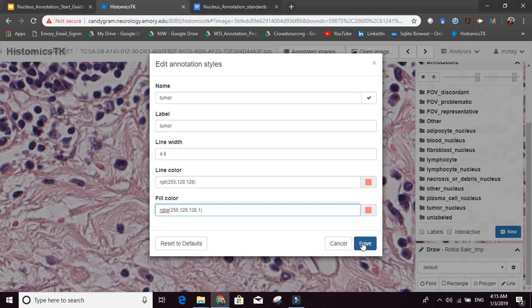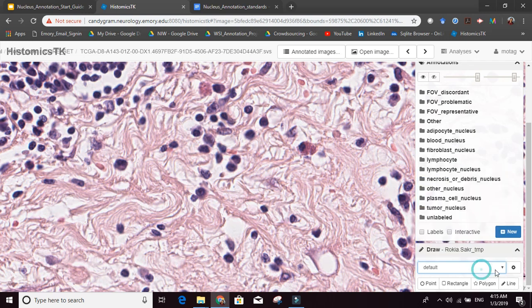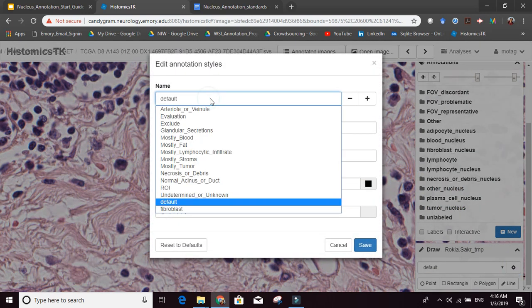So now that I have this defined, I click Save, and then I go here and I check tumor. Where is it? Did I really save it? I don't think I saved it. Very stupid of me. That's why I said you need to clear your browser cache. If you clear your browser cache, you wouldn't have all of those old styles. I have all of these old styles in my browser, and I unfortunately didn't clear my browser cache. So if you did, you wouldn't have to deal with this.